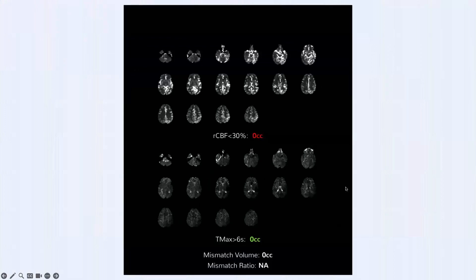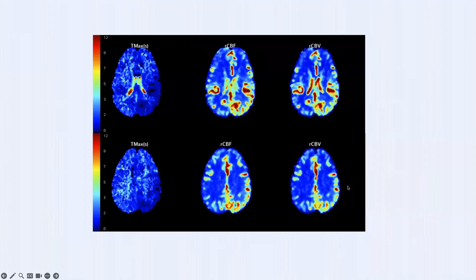Case 5: acute aphasia and confusion, ASPECTS 10, nothing to see on CT perfusion numbers — zero and zero. But the color maps show decreased, dark-blue Tmax in the left MCA and left PCA territories — left temporal, parietal, and occipital — opposite of what I've been showing. On CBF and CBV maps, there's actually elevated cerebral blood flow and volume: this is hyperperfusion, specifically hyperperfusion from seizure.